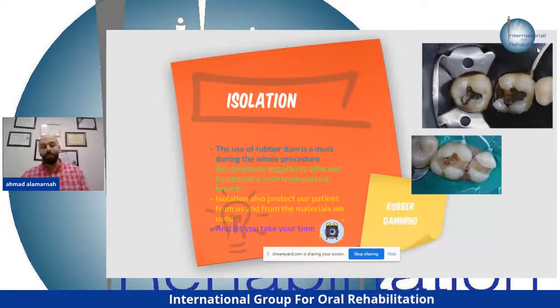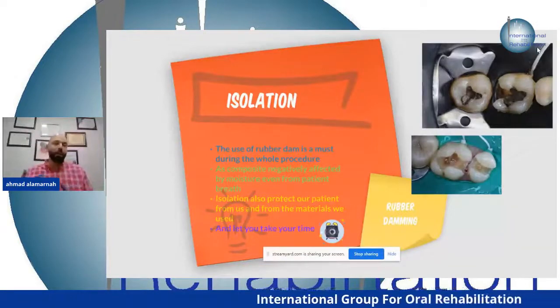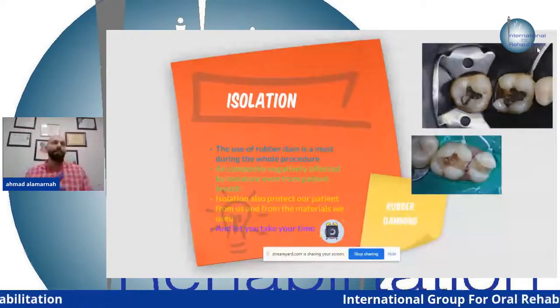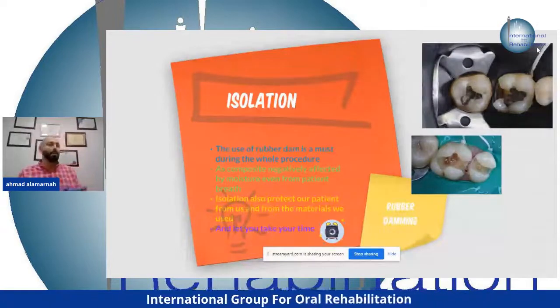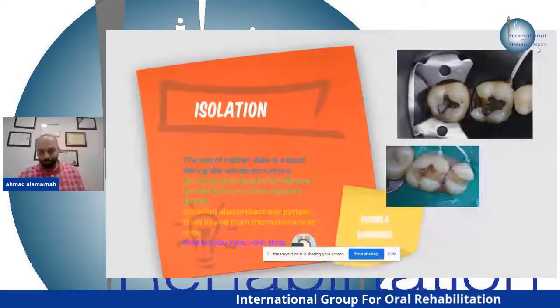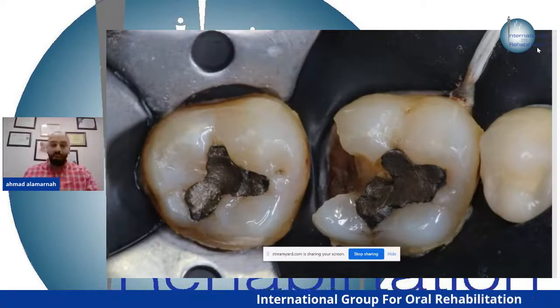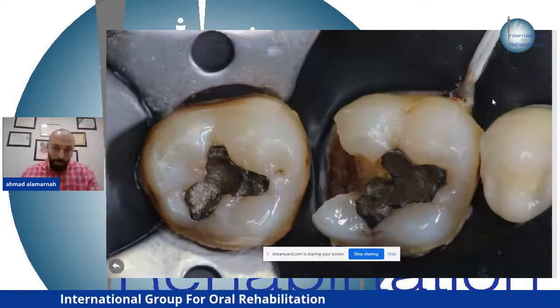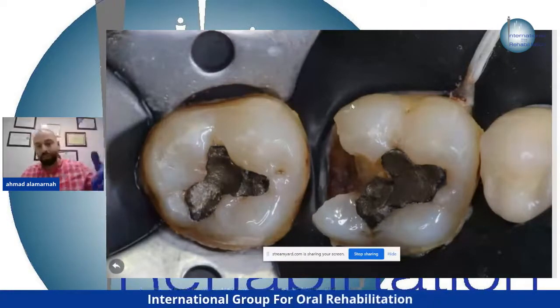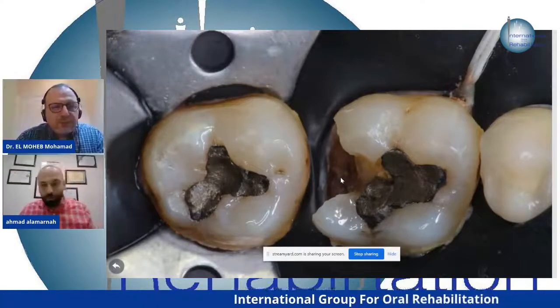Because it's technique-sensitive, we must use rubber dam. Rubber dam protects the field we are working with, gives the dentist the time needed, gives the patient comfort, and protects from amalgam debris when removing amalgam. In this picture, I isolate teeth 7, 6, and 5. Look at the involvement of the rubber dam around the sulcus of the tooth.